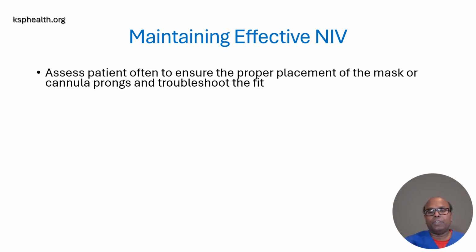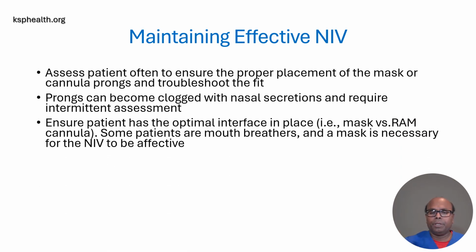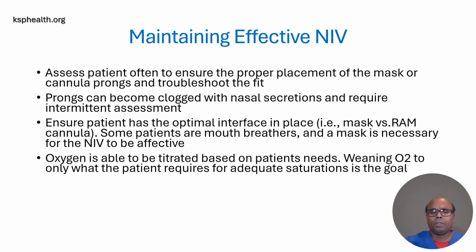Maintaining effective non-invasive ventilation: assess the patient often to ensure proper placement of the mask or cannula prongs and troubleshoot the fit. It's very important. Prongs can become clogged with nasal secretions and require intermittent assessment. Ensure the patient has an optimal interface in place, like a mask or RAM cannula, that is very appropriate for the patient. Some patients are mouth breathers and the mask is necessary for the NIV to be effective.